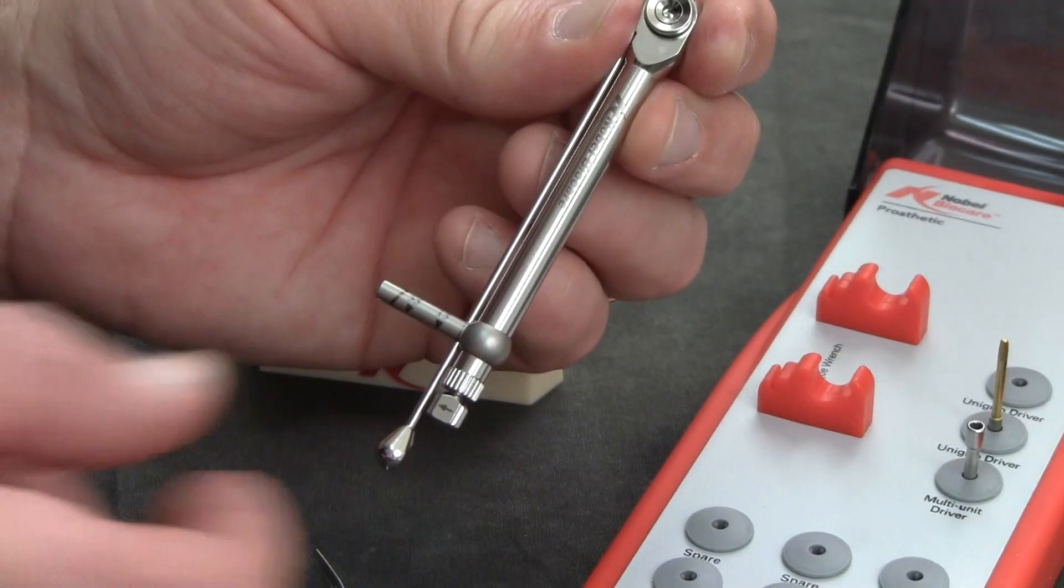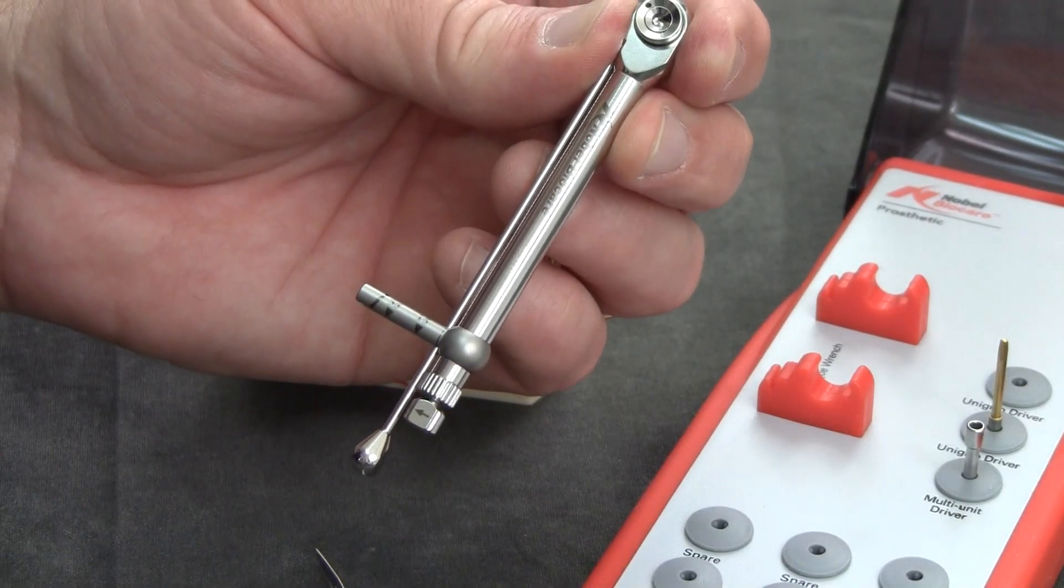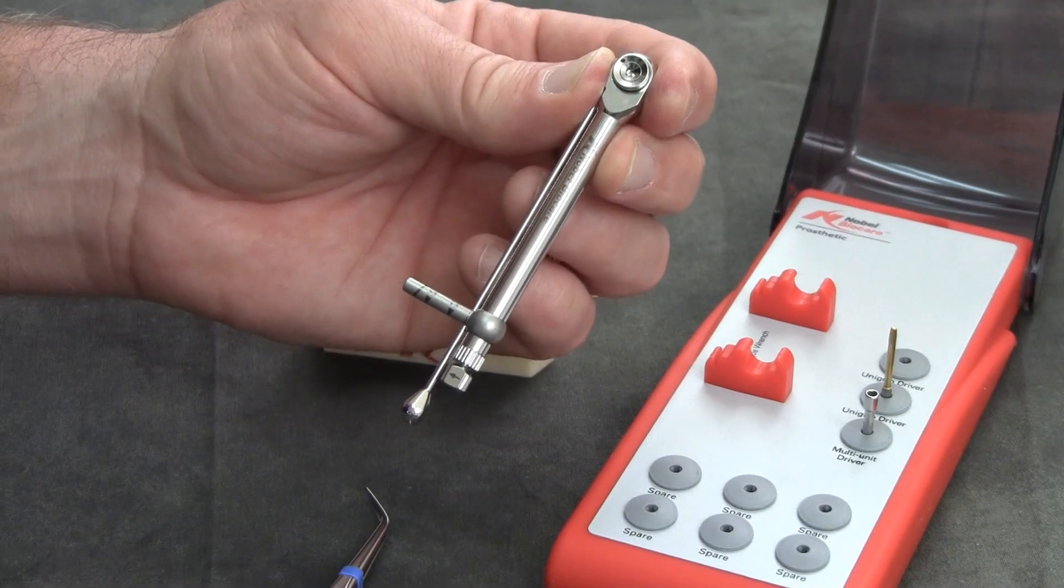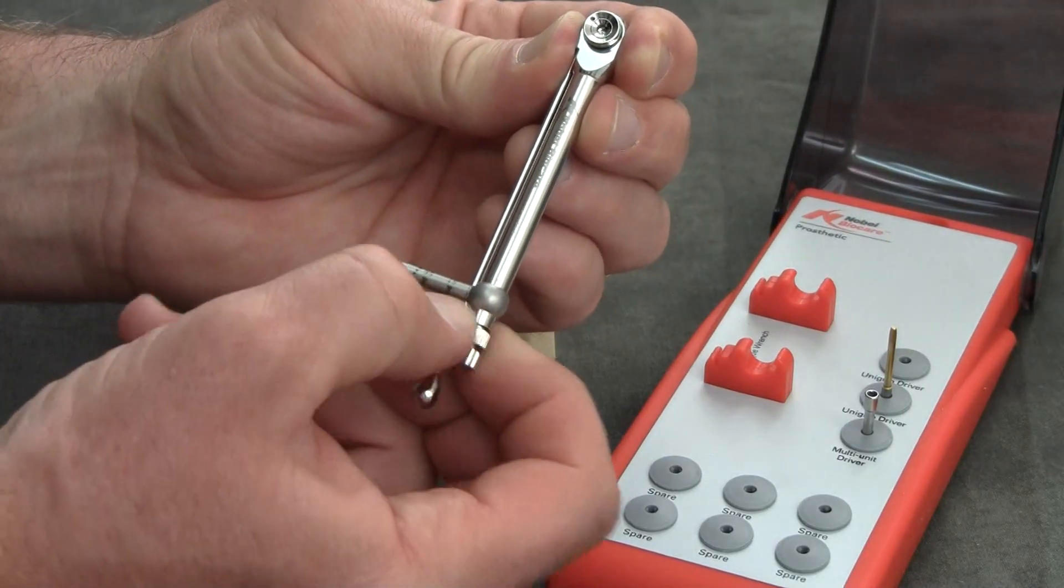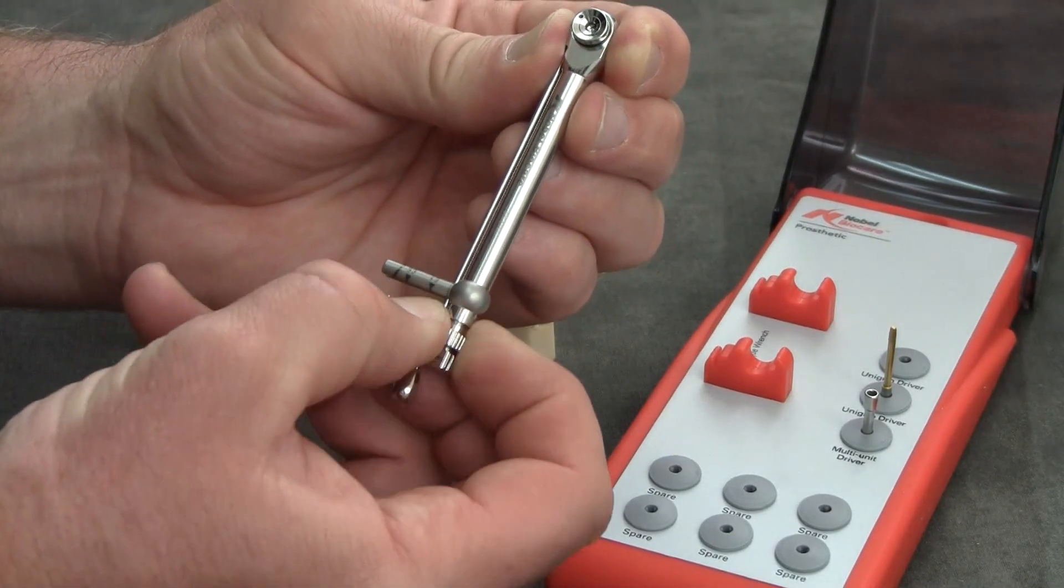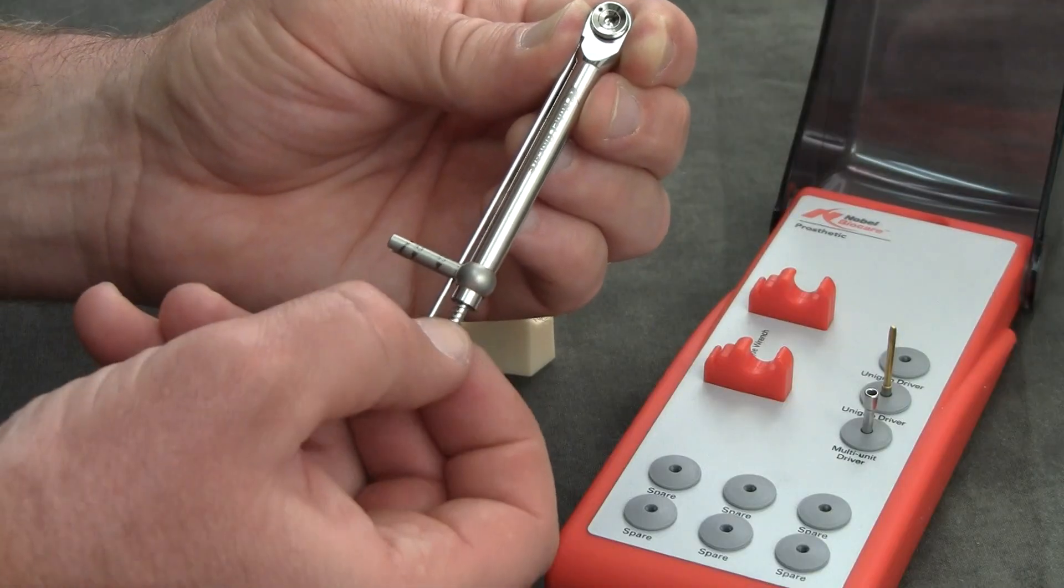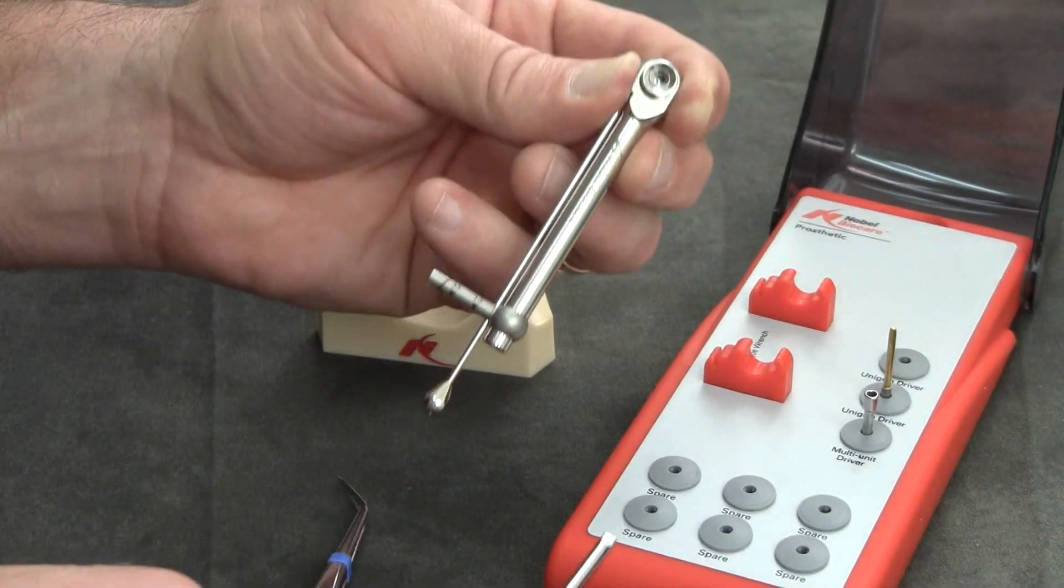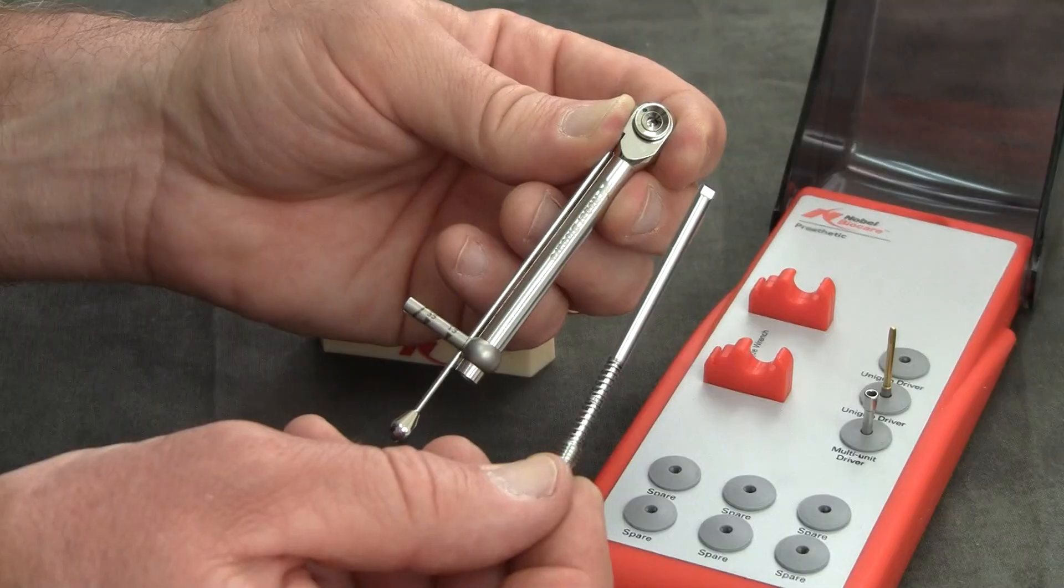When cleaning the torque wrench is necessary, simply unscrew this knob all the way until that central shaft can be pulled out freely, entirely. Thoroughly clean these parts.